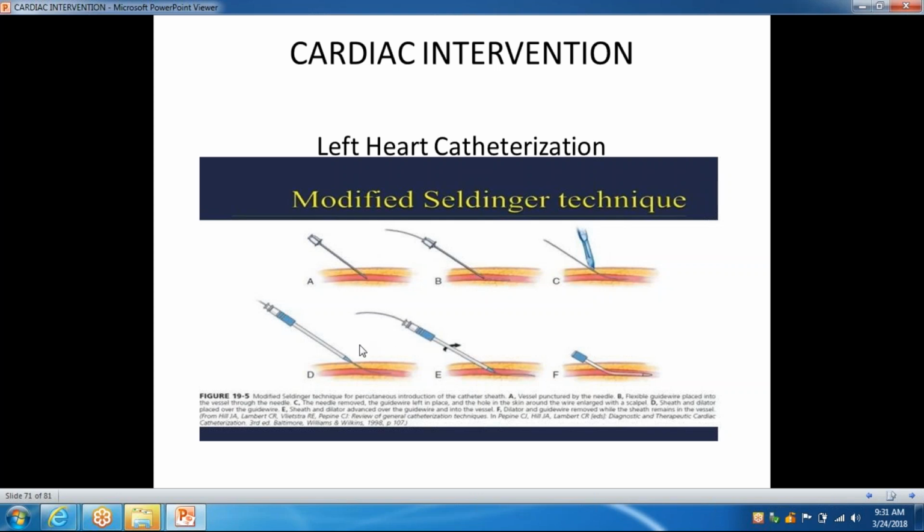So the plastic sheath comes with an introducer, because without the introducer, the sheath is going to be too flimsy. So you position your sheath with your introducer into the blood vessel. Then you remove the introducer, which is a stiff plastic tubing. You remove that, and then you leave just the sheath in place. The sheath is not very stiff, and it stays in place, so you can access the artery from time to time.